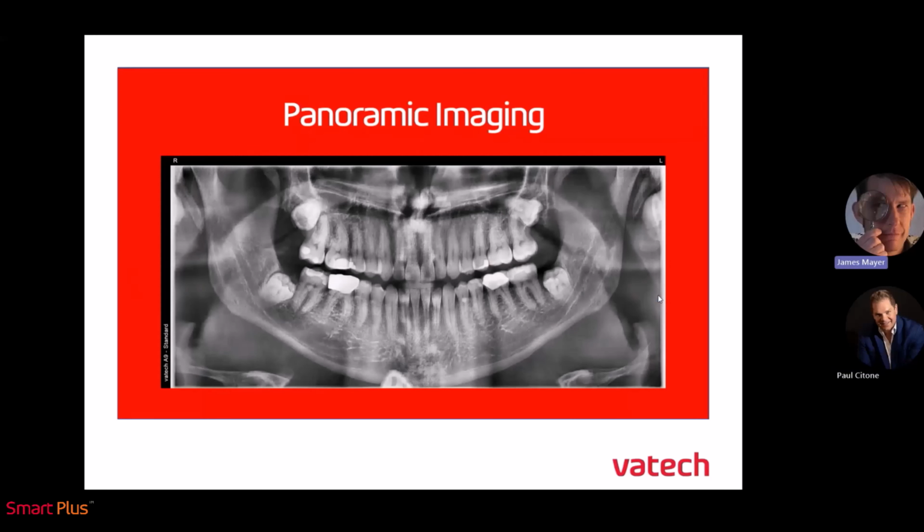What are you seeing here on this image? See that little white area on the bottom portion of the image, which is going to be the vest essentially creeping up on the back of the neck, causing that little white spot there.